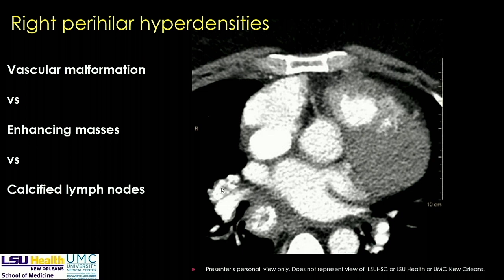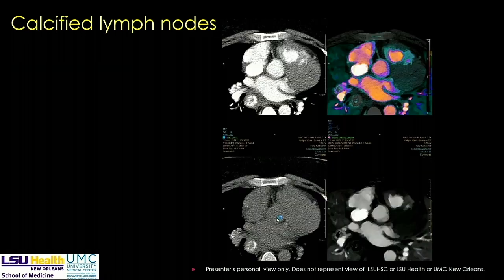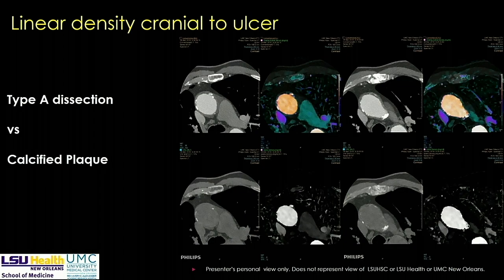Another patient presents with hyperdense lesions. You could always go back and do a non-contrast CT to determine if these are calcium, vascular malformations, or enhancing masses. But if you have spectral CT data available, just load it up. On virtual non-contrast, it is clearly calcium, not iodine. If someone is still skeptical, go to the iodine map — the areas are dark, showing no iodine. These are calcified lymph nodes.